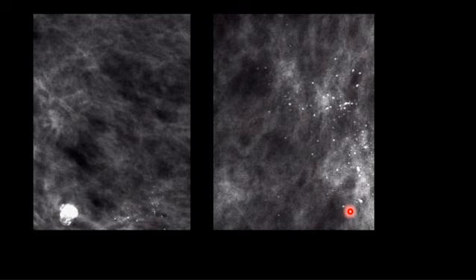They are not variable, not faint to high density. They are all of the same density, indicating that it's not very significant. And when you see this shrapnel and multiple pieces of it in the adjacent breast parenchyma, confirming of course with the clinical history, you confirm that this is just an artifact.